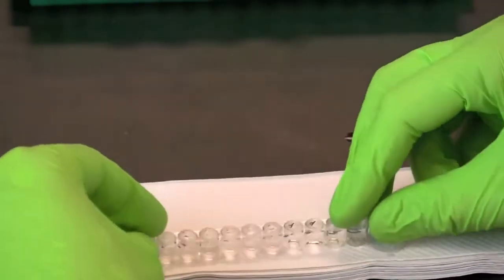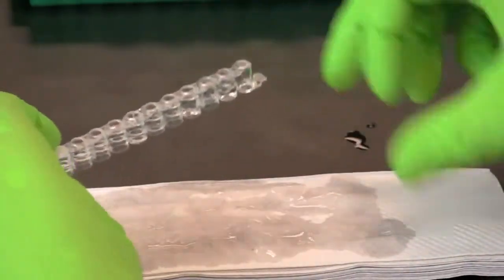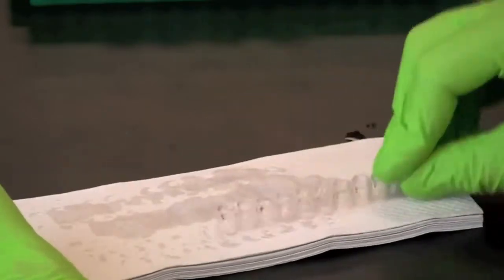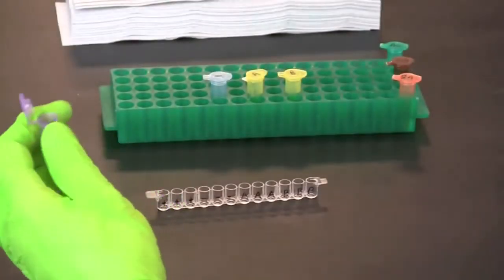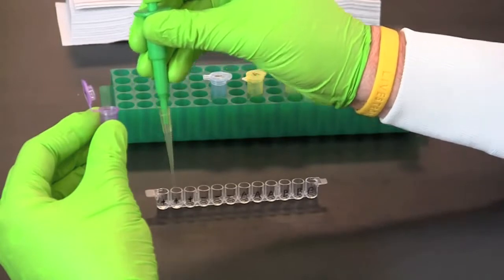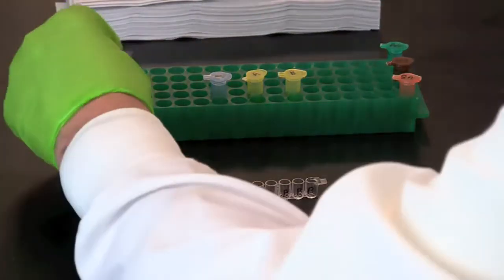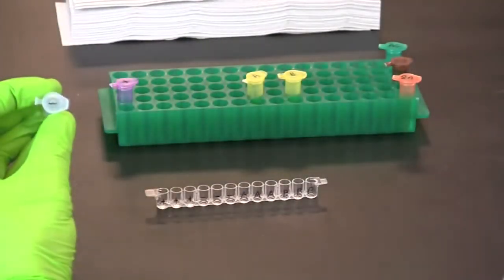Tip the microplate strip upside down onto a short stack of paper towels and gently tap the strip a few times to empty the wells of wash buffer. Use a fresh pipette tip to transfer 50 microliters of the positive control into the three wells labeled plus.